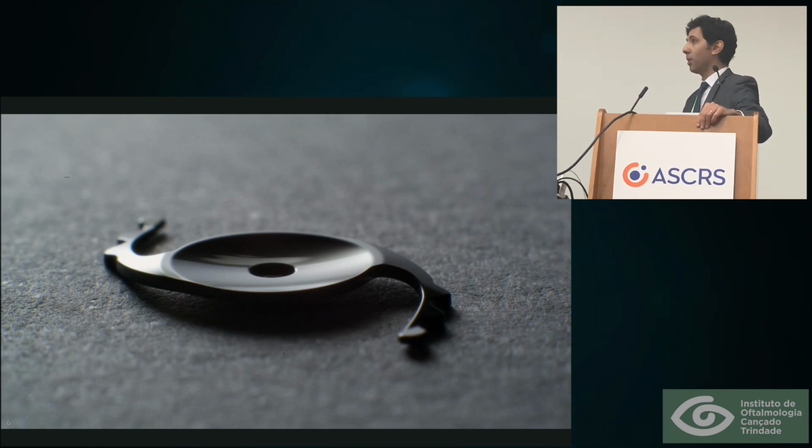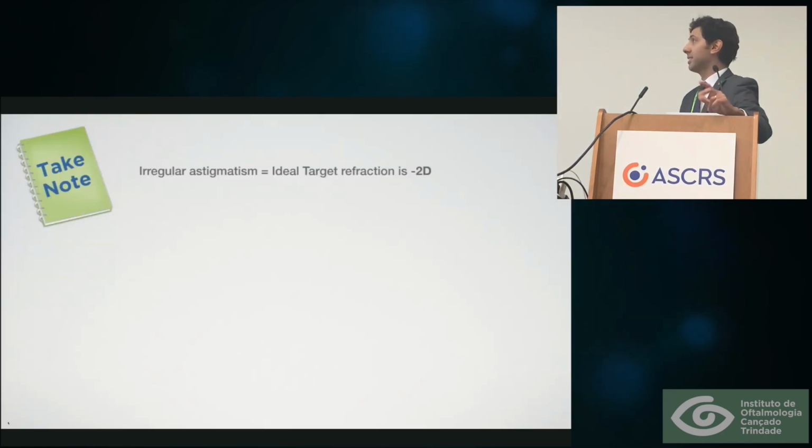And this is very important when we have an autorefraction reading after implantation, because remember that autorefractors operate with infrared light, and the infrared light will go through this occlusive portion, and this meniscus will act as a lens to the autorefractor. So you will get a false reading because of that. So this is an important point. After implantation, you might get some really different or unexpected result from an autorefractor. This should be discarded because it's totally unreliable.